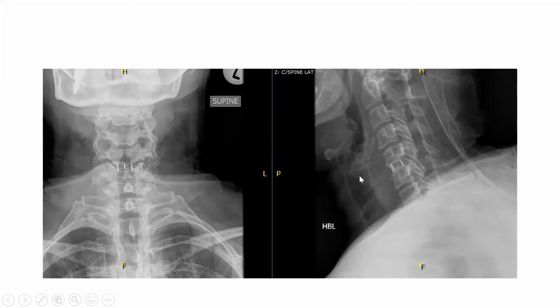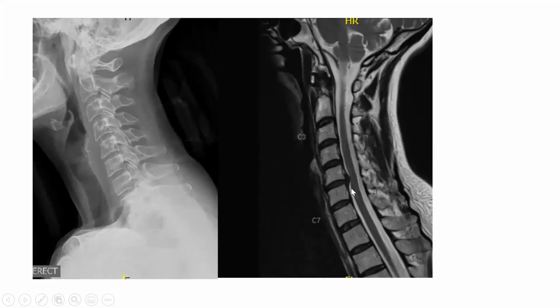And this one's made of PEEK. But now, long term, this is stiffer. That's already quite narrow, so you have to work harder above and below. I'm worried about that. There's another patient with a nice big fat juicy disc in a cord. This is bread and butter stuff.